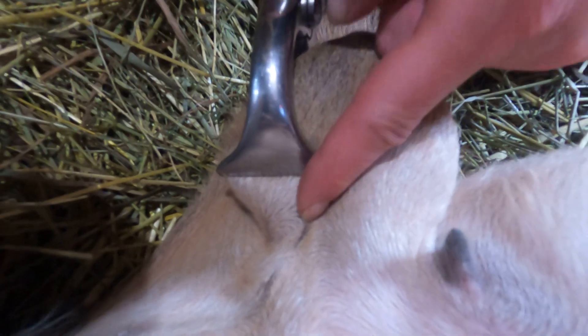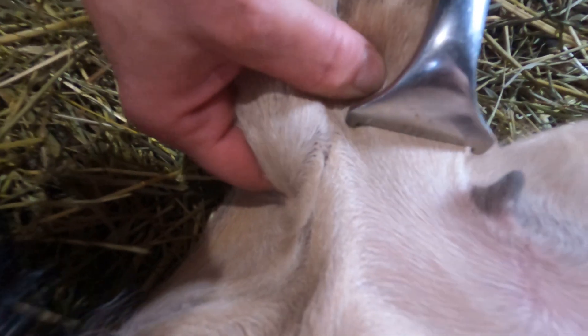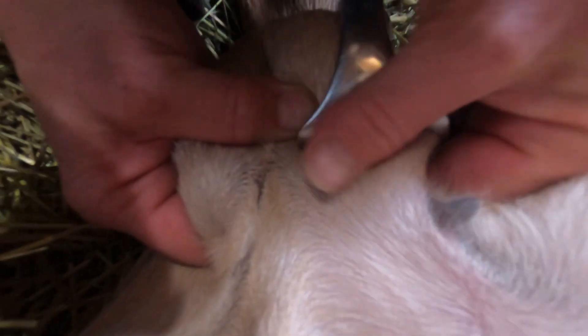She crimps each spermatic cord two to three times. She palpates the scrotum to make sure she can feel the spermatic cord going through the emasculatome. It sometimes slips up to the side, which causes the procedure to fail. Palpation also checks to make sure that the testicle didn't slide above the emasculatome, which also causes failure.